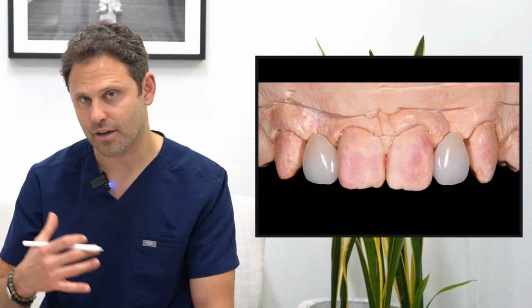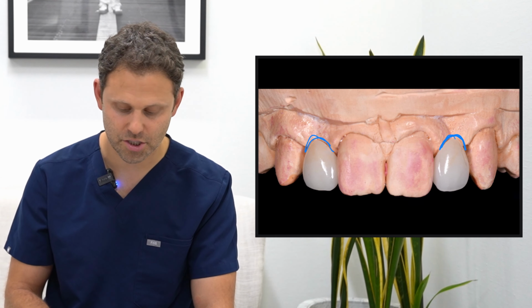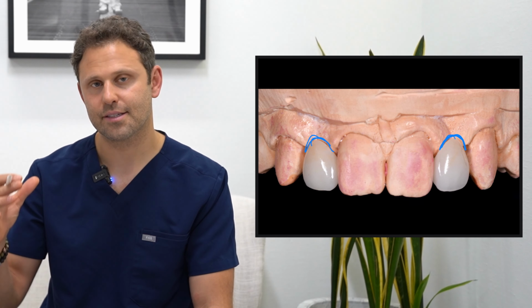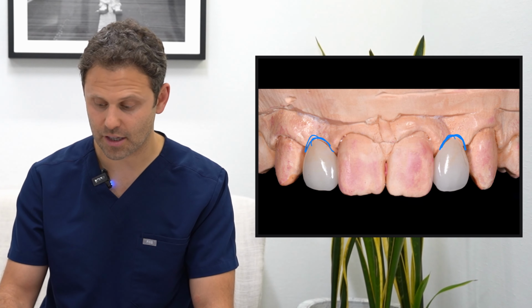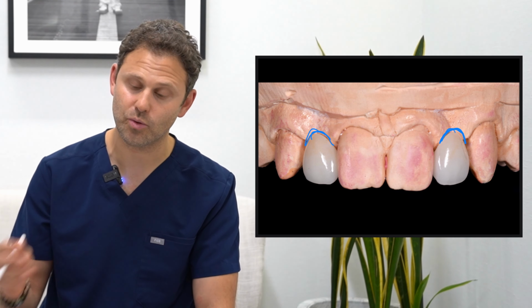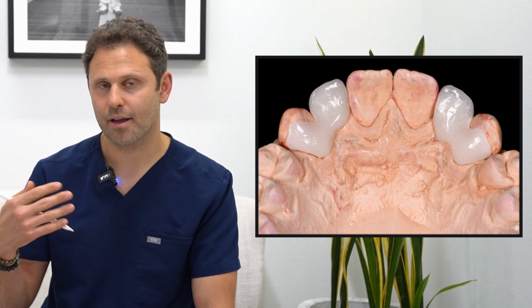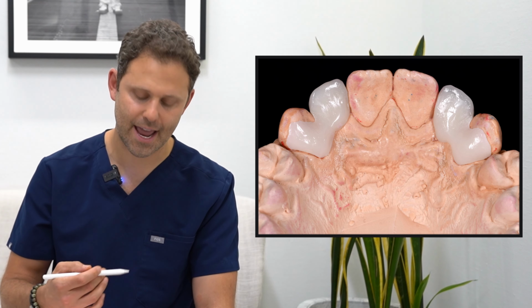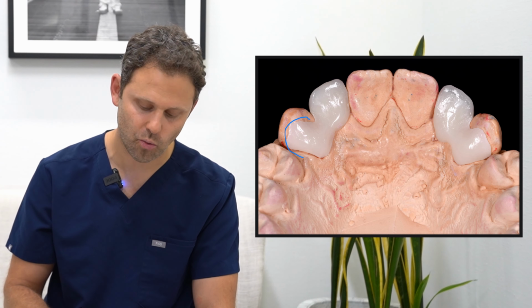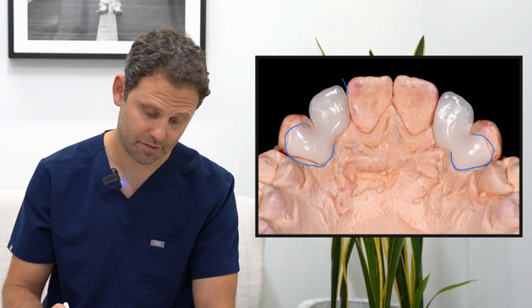Again, like we talked about, it's all about the shapes, finishing the Maryland bridge in the tissue area so that it's tight enough, but also able to clean. And really important also is, are you doing 2 wings or 1 wing? That all depends on the person's bite, how much tooth there is to hold on to, so many different factors. But if I can, I try to keep it to 1 wing on a side, so that the patient can then floss in here.